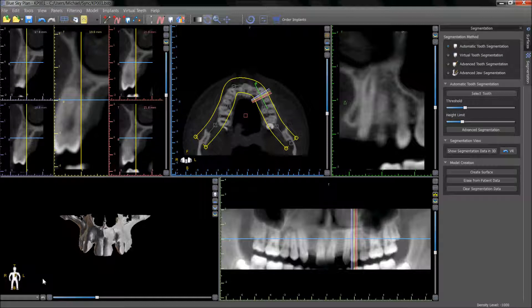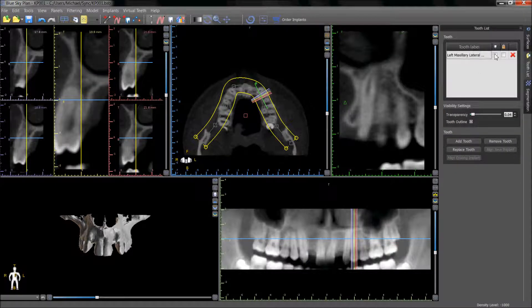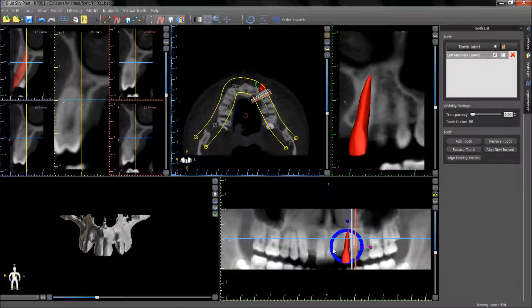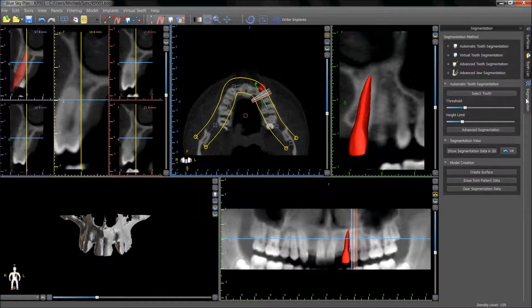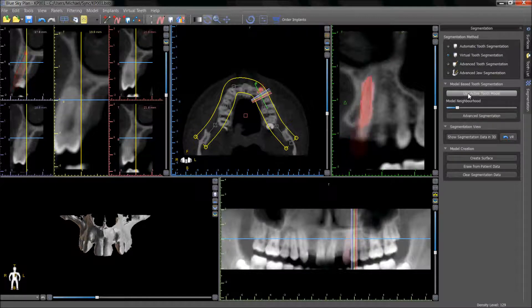Another way to segment a tooth is by using the placement of a virtual tooth. Once the virtual tooth has been placed in the desired location, the virtual tooth segmentation option can be used and pressing use active tooth model will highlight the relevant area.